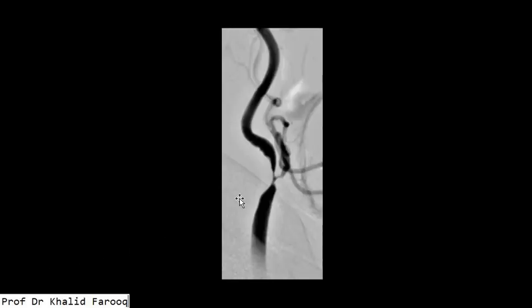This is another example where we can see common carotid artery, and this one is the external and this is internal carotid artery. Severe stenosis is appreciated because of atheromatous changes in this junction.